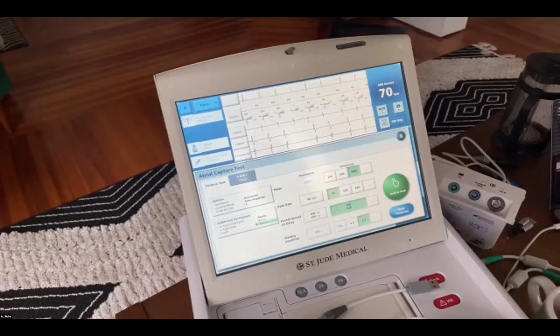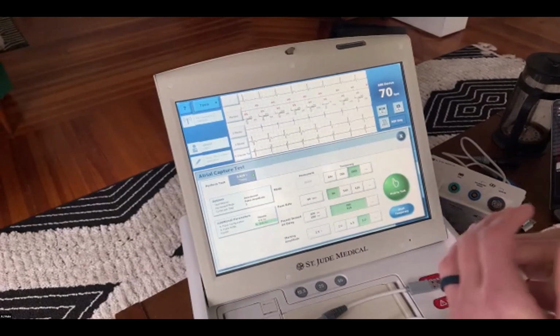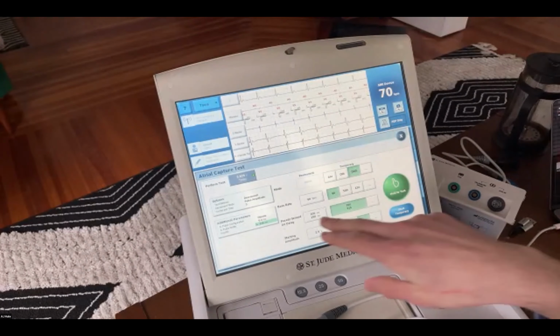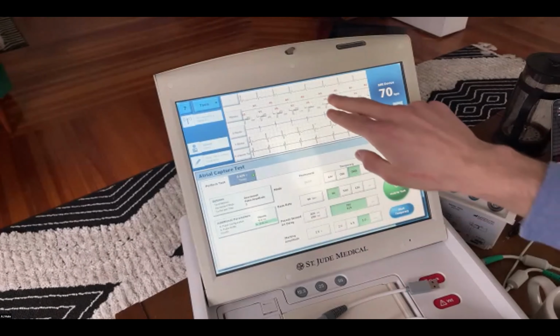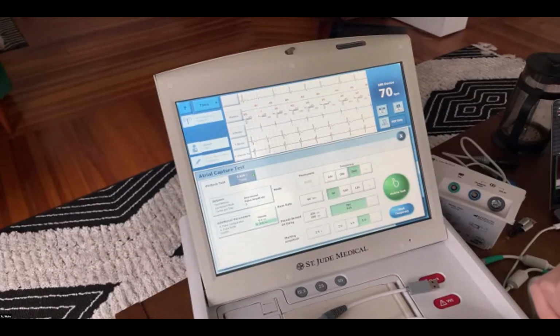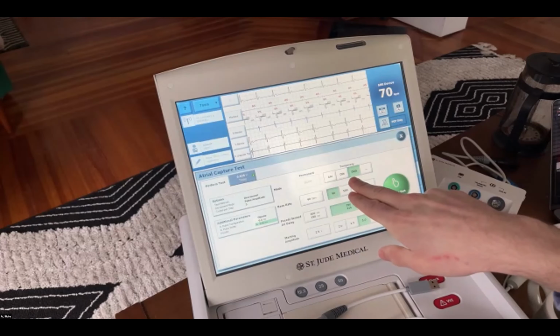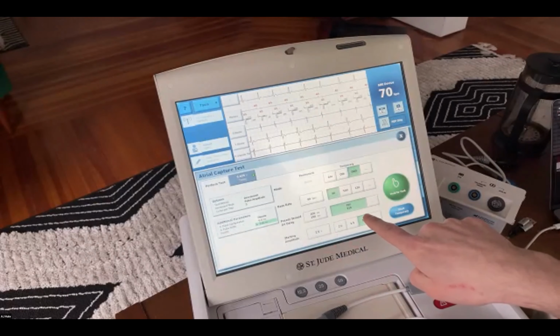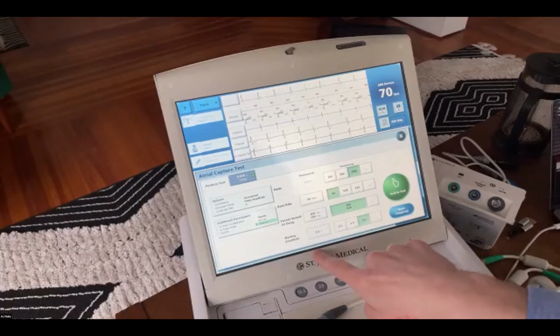If you're looking for atrial capture, things that make it kind of easy are, do they conduct? If they actively conduct, then use nice long AV delays and look for the associated ventricular event after each atrial pace. That's a good way to know that you're actually capturing the atrium. Once you start V-pacing, it's generally a pretty good indicator you're not capturing the atrium. Here's where you'll select the mode you'll use, the rate you'll use, how long the sensed AV delay is, paced AV delay as well, and then the starting amplitude.